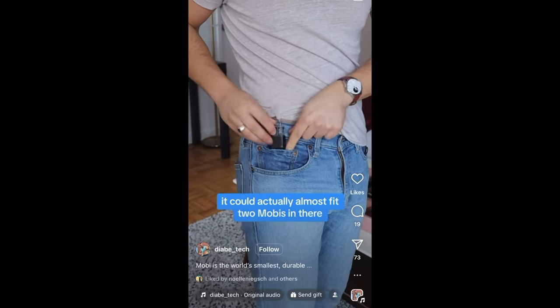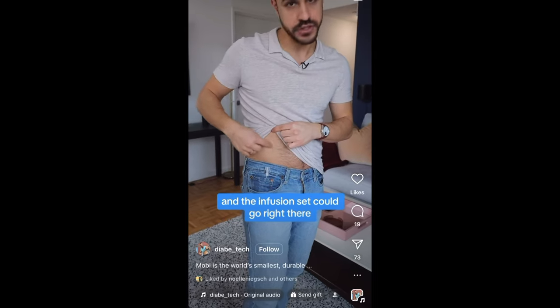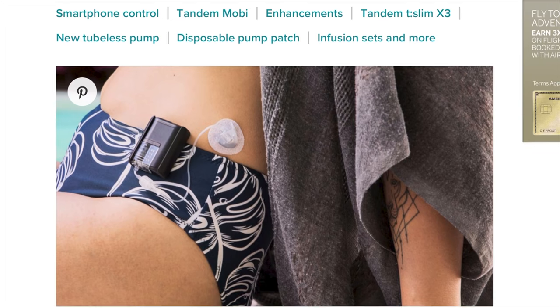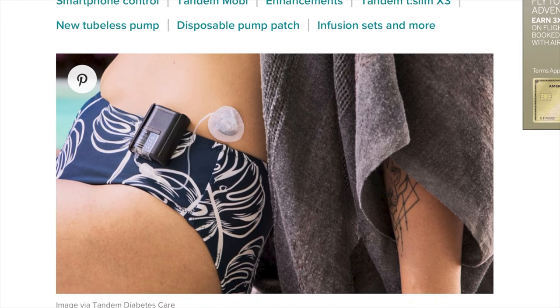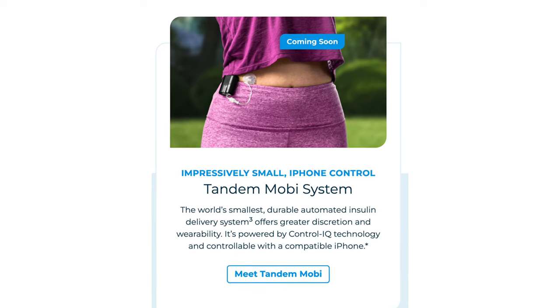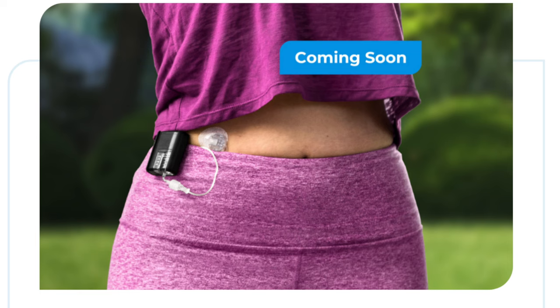There are three different ways you can wear the Mobi. The first is pretty standard — putting it in your pocket. Because it is so small, it fits in that tiny change pocket of jeans that nobody uses anymore; it is like the perfect Mobi pocket. I tried it on social media and it fits super snug. The next way is by clipping it onto clothing using Mobi accessories — great for when you're active or on a run.